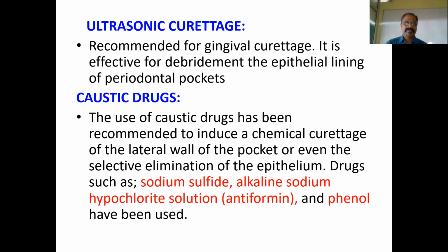Along with that, you can do a very nice curettage process. But again, the recent concept says that whether you use a hand instrument or ultrasonic, if you use it properly with a proper technique, both are equally effective.